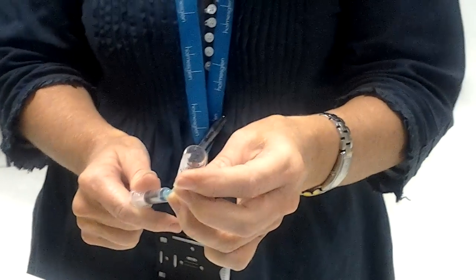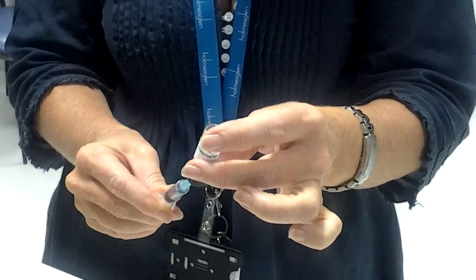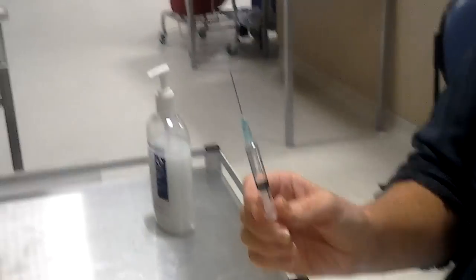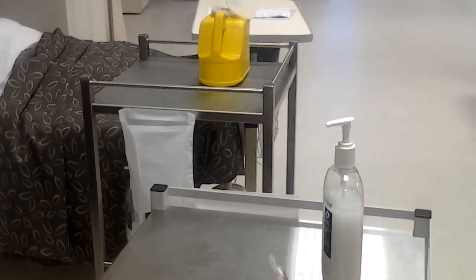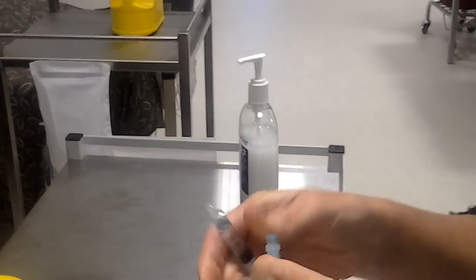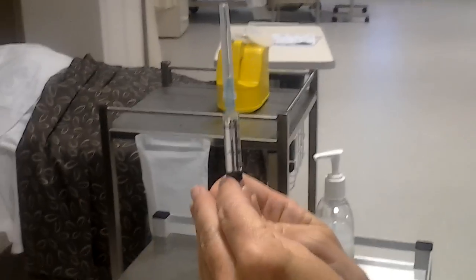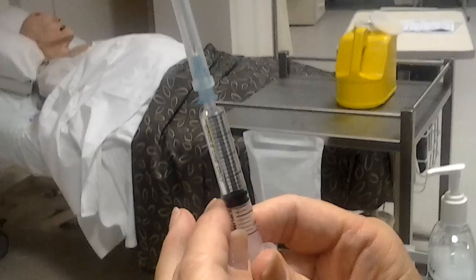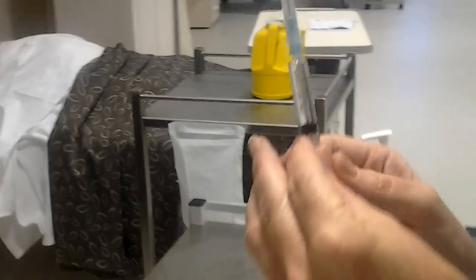Ensure you don't contaminate the needle while drawing up the medication. It's good to do this at eye level so you can clearly see the volume you are drawing up. Remove the needle and attach the injecting needle. Ensure you have the correct volume. Ensure there are no air bubbles. 2 mils, no air bubbles.